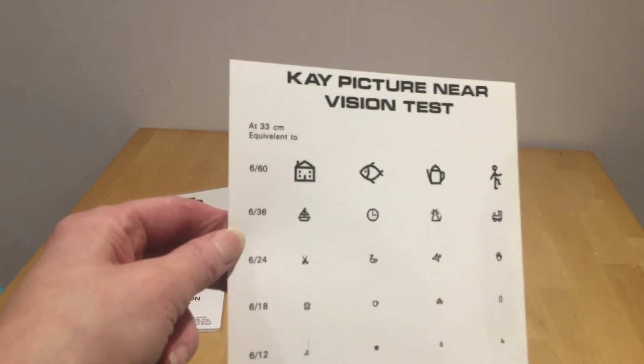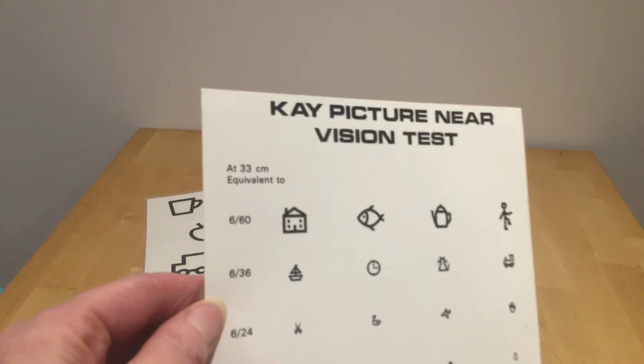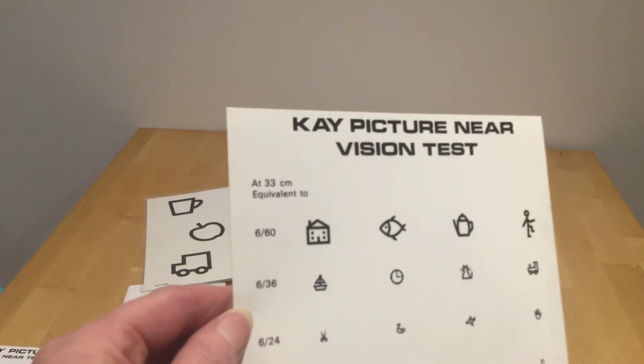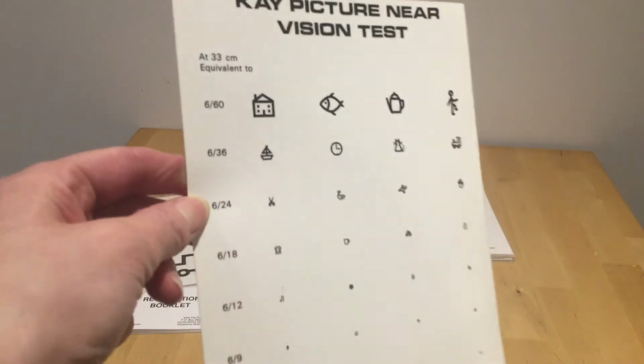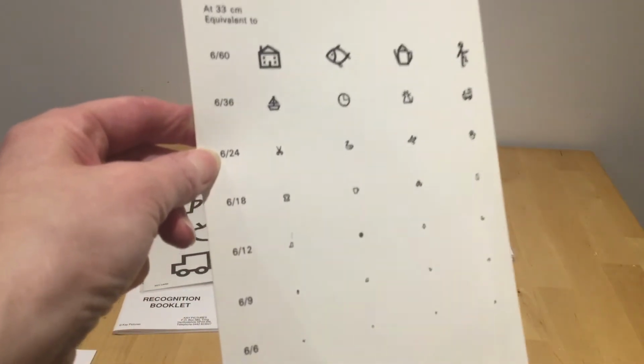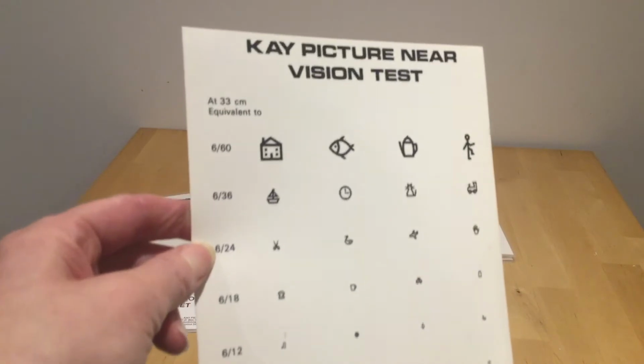You'll notice in other near tests, although as I've said, this is not a near test, it was about the child going as close as they wanted. If you weren't at 33 centimetres, you would invalidate the scores down the side. So just that is something to be aware of.